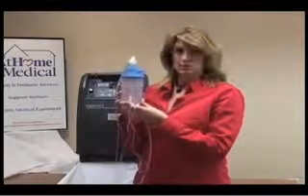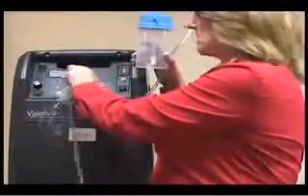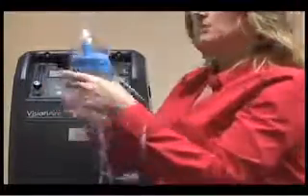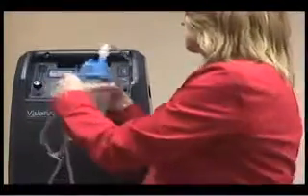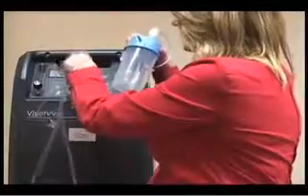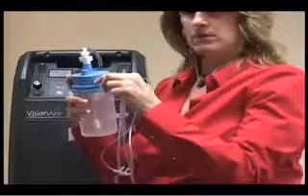If you are experiencing trouble with drying or nosebleeds, you can add a humidifier to your concentrator. You will remove the tubing from the concentrator and replace it with the tubing from the humidifier. The other end that you've taken off the concentrator will now go onto the port of the humidifier bottle.